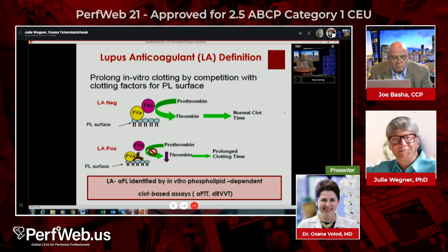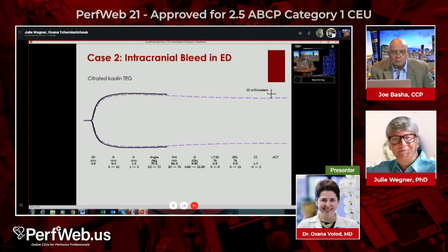But again, as you can see, her TEG gave me an idea of what next steps I should take, and I asked the surgeons not to give her anything until I figured it out. And that particular day, I was able to figure out the situation within several hours. So let's move to another case.